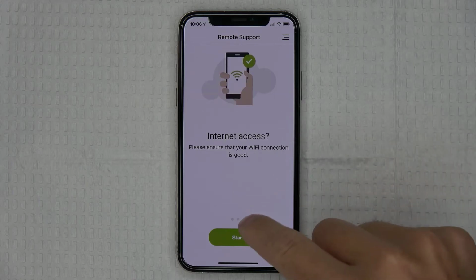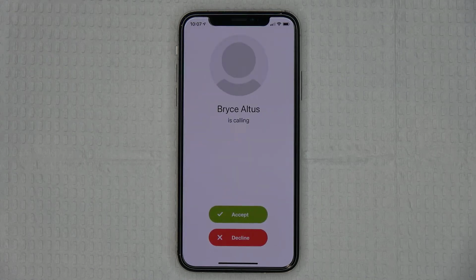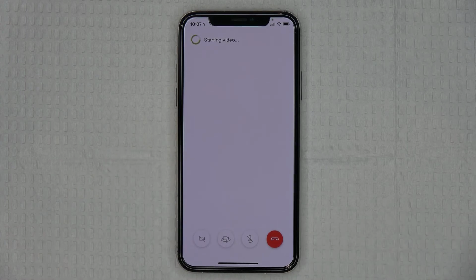Once you hit Start, you'll see a screen that's saying that your phone is looking for your hearing care professional. Then once I or any of my colleagues here in the clinic initiate a remote support session, you will then see that we are calling you, and you have the option to press Accept or Decline. To initiate the session, though, you have to hit Accept.